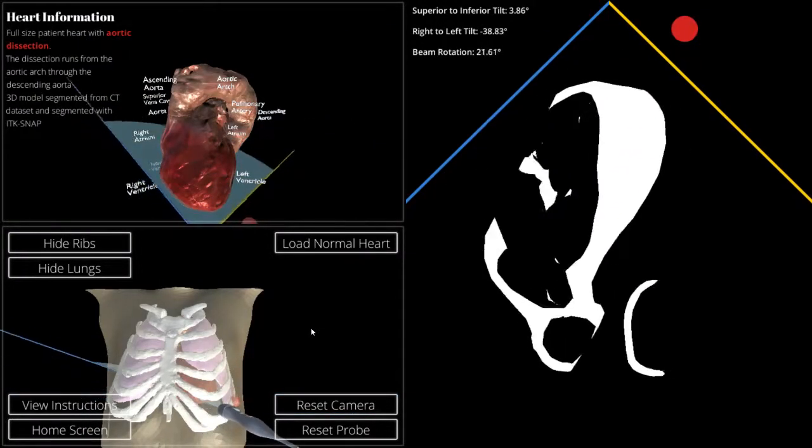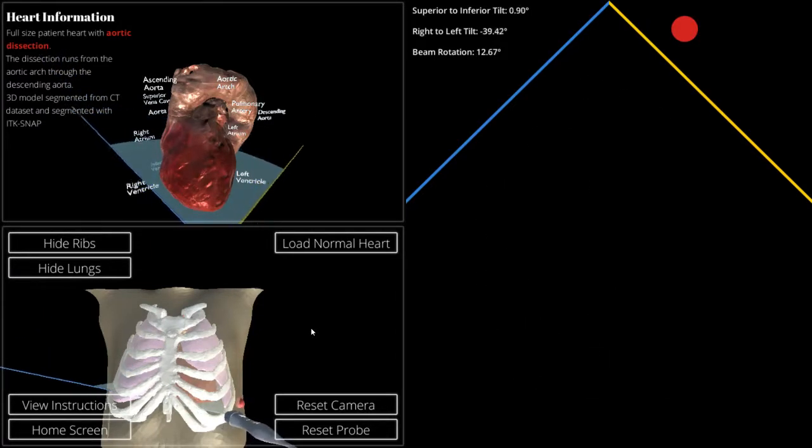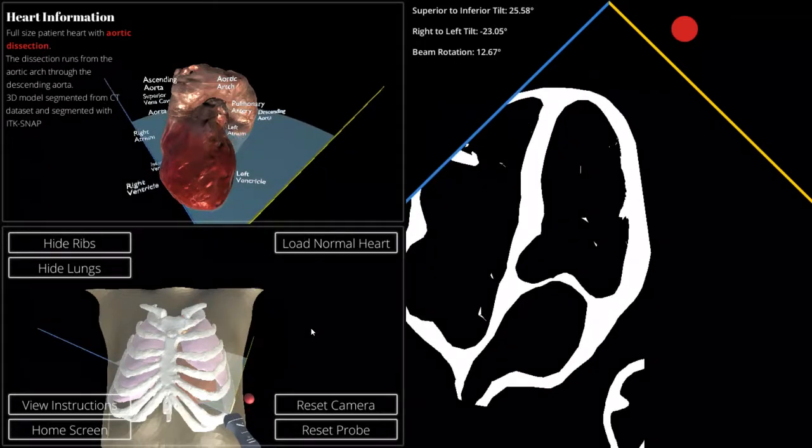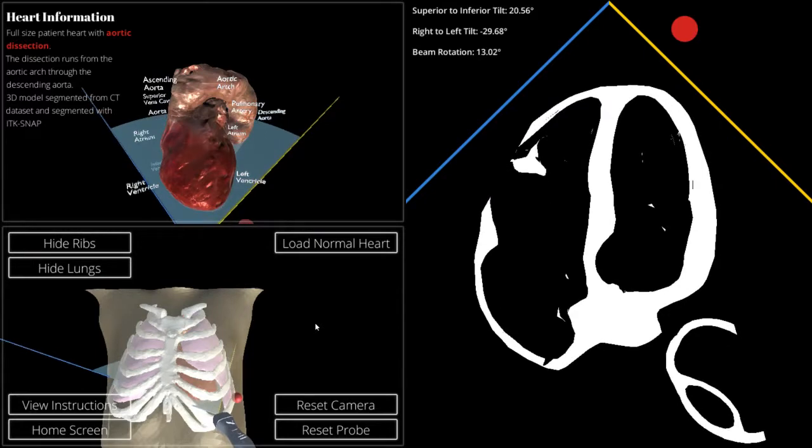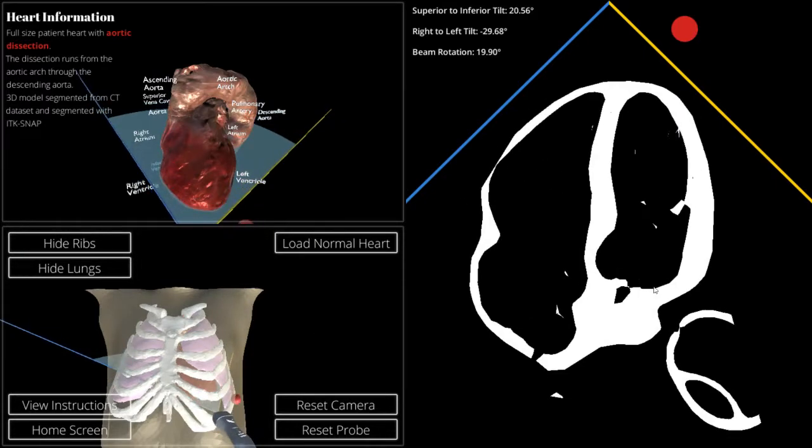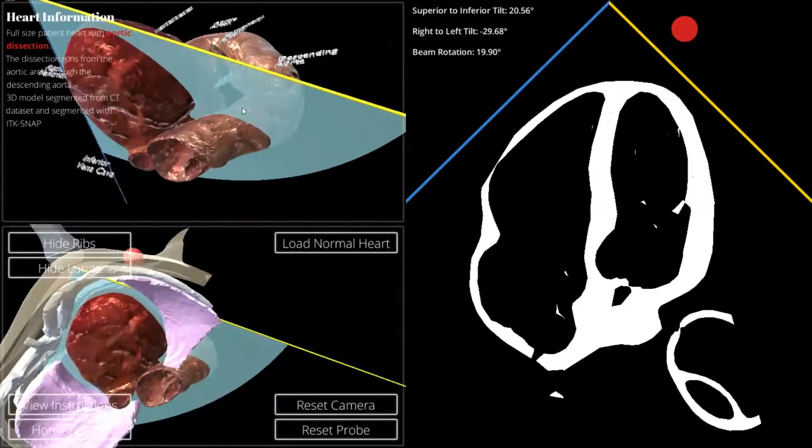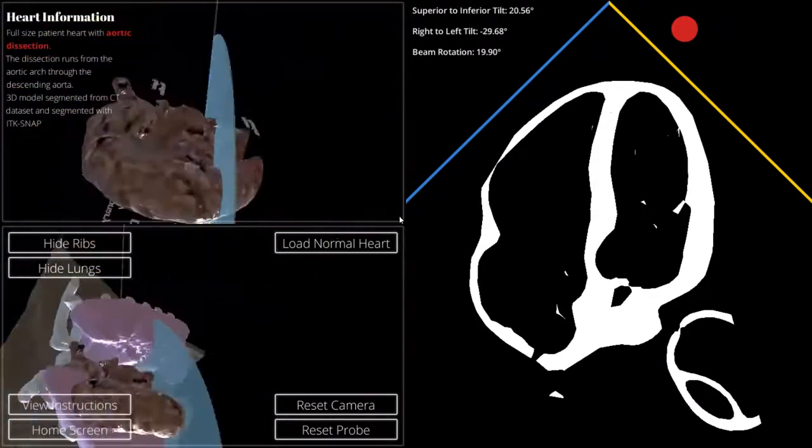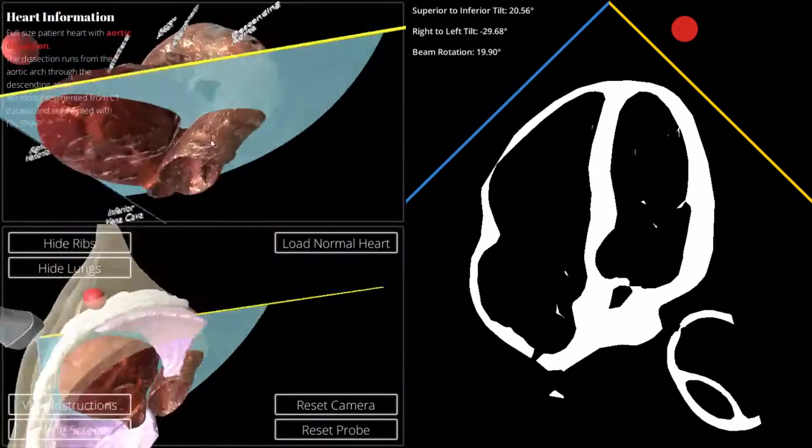We'll move back over and see if we can identify that aortic dissection. There it is. So as you can see here, we get the two chambers of the heart, including the aortic dissection throughout the descending aorta. We can actually see exactly what structures we are cutting through on the heart when we switch over to this view. And we can toggle on and off between the normal heart and the pathological heart whenever we want.